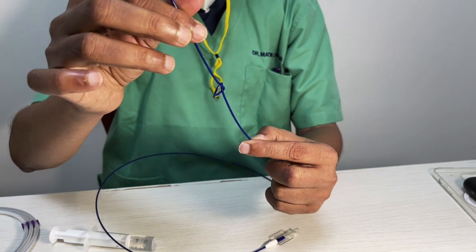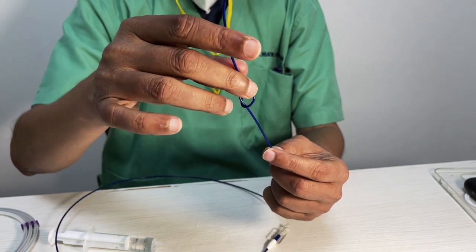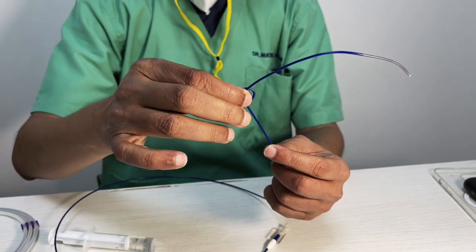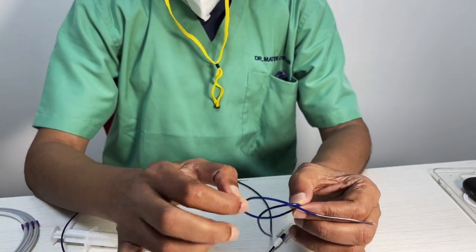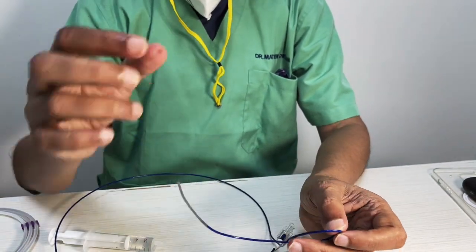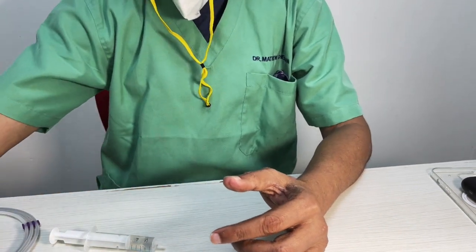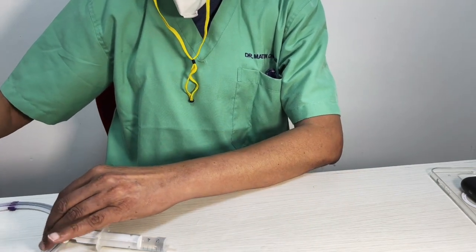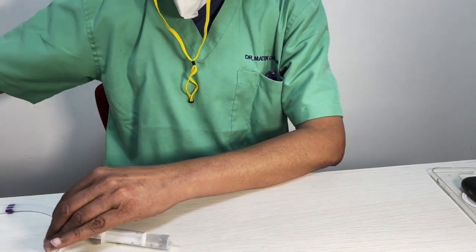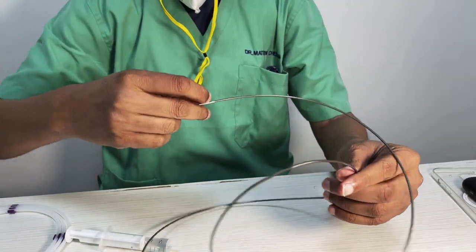And this is because they use a combination of a cobalt nitinol braiding, which is a little different from any other company. The same technology has been carried on to their suction catheters. And I'll show you, for some reason, what we see as a DAC catheter is nothing but an extension which was extended to become an aspiration catheter. Now, this is the ACE.